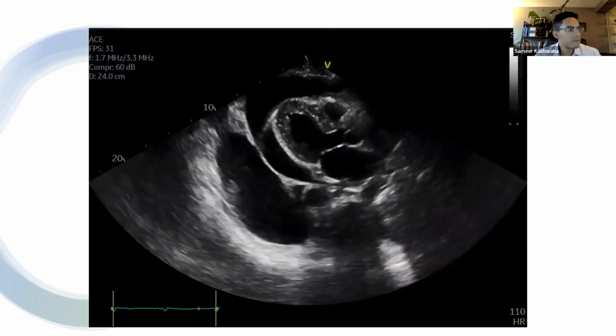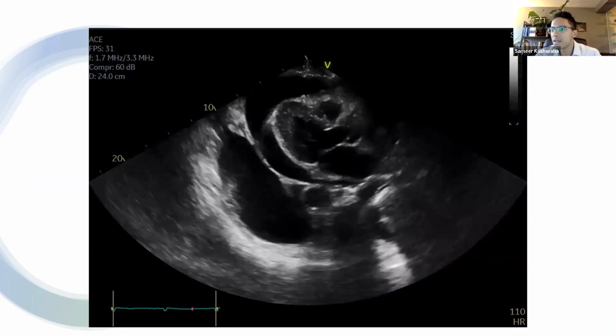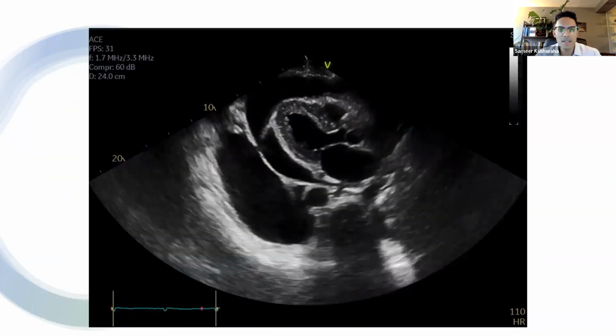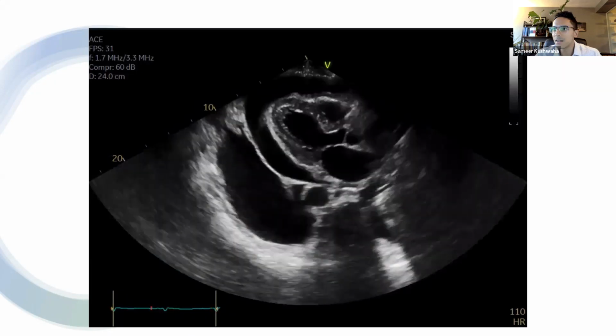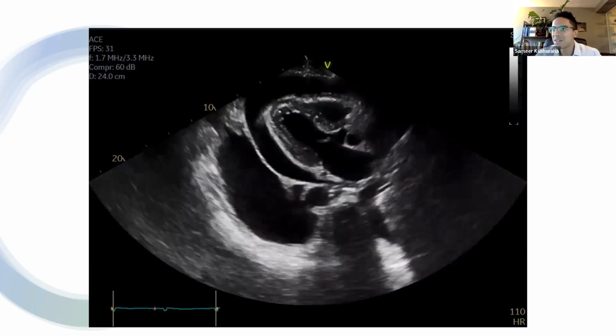So this is our first demonstration echo. I don't know if I have any of the cardiology residents on the line who want to just briefly say what they see. I know it's a subtle finding. If no one speaks in about 10 seconds, I'll just talk myself.